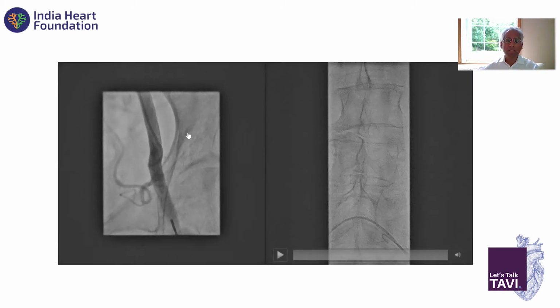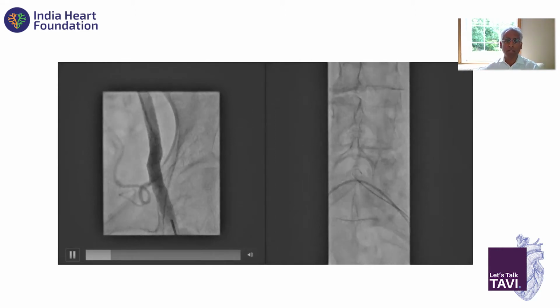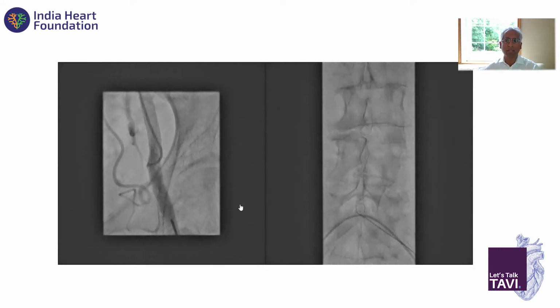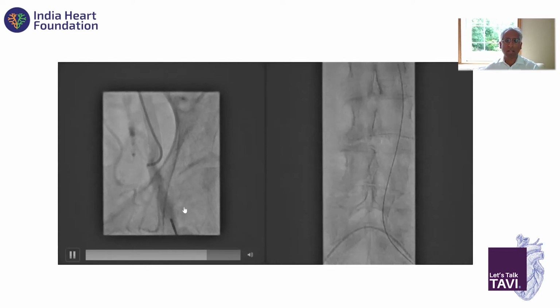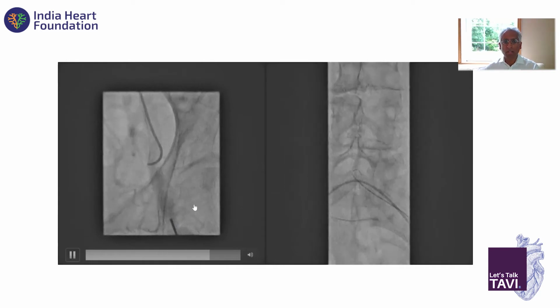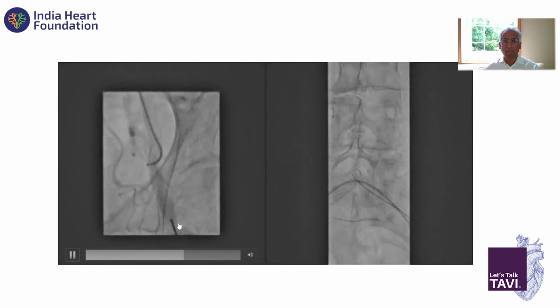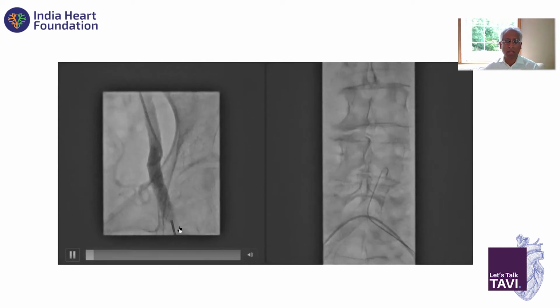So here's the case again. We've seen how there are many ways of puncturing the femoral artery. I agree with Peter, Sai, and Susheel that ultrasound guidance now is very safe and minimizes radiation to you. But what I wanted to show you here is that when I used the ultrasound, the artery was so mobile that I wasn't happy doing that. So I'm good at both.